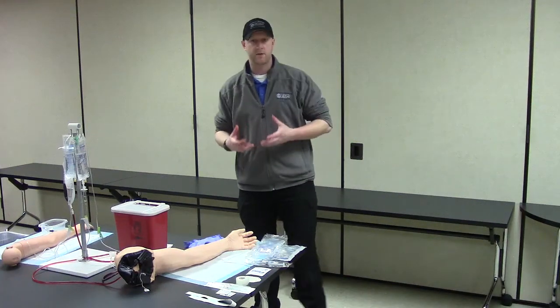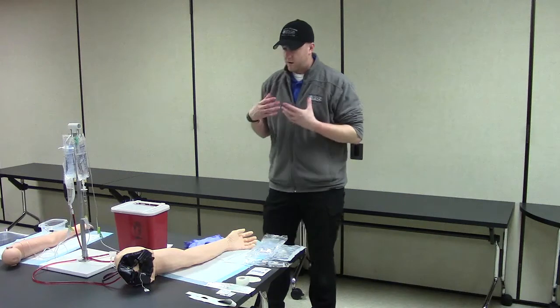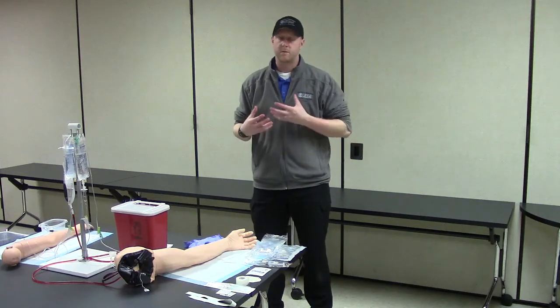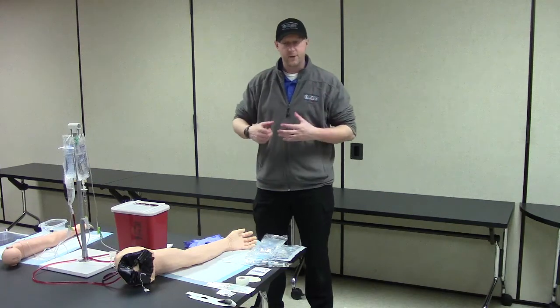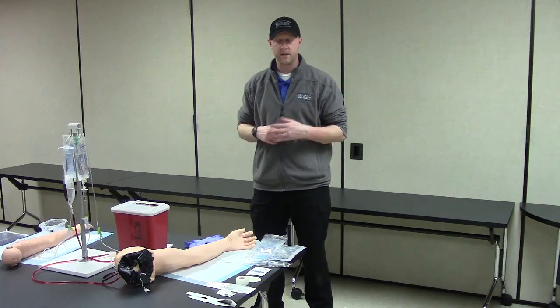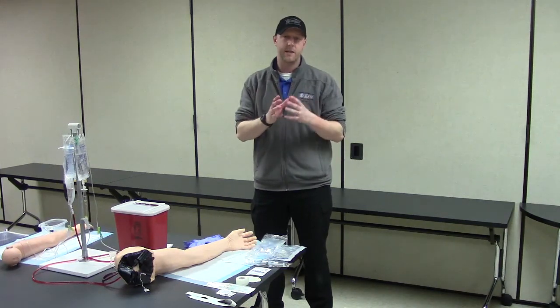This video is to show you how to start an IV. First things first, we need to think about why we're starting this IV. Are we starting it because we have to give medications? Are we starting it because our patient needs fluids? We have to determine why we are giving this.